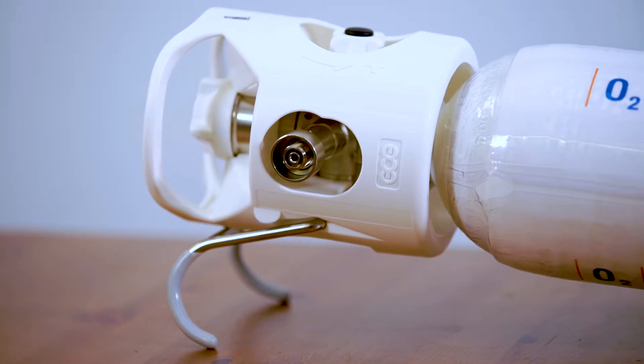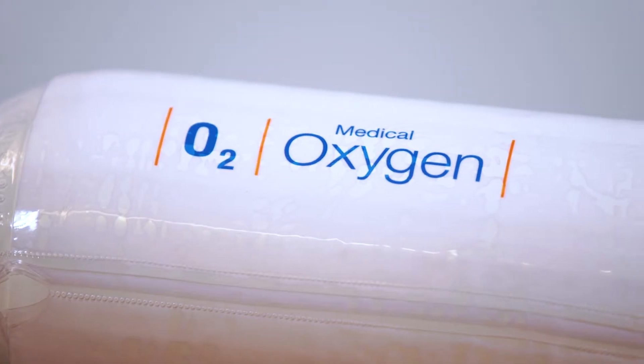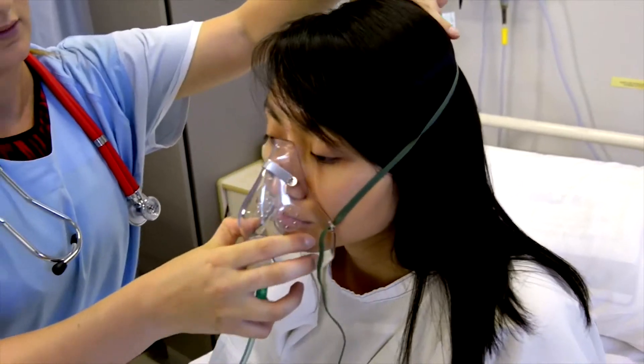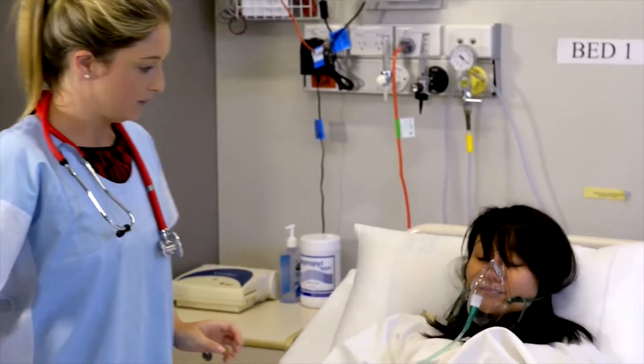With its lightweight ergonomic design and versatile functionality, the Coregas IVR is easy to use and saves valuable time where it counts. Because of its practical size and integrated regulator and flow meter, the Coregas IVR offers greater efficiencies in lowering operating costs.